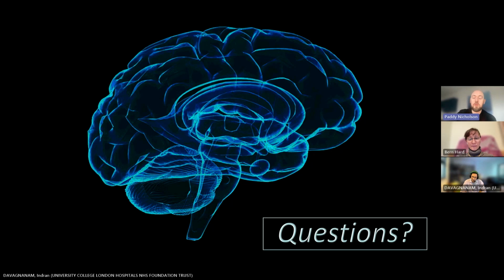So for me, that's when we use a combination of imaging. I will generally start off with a digital subtraction myelogram, because, first of all, I'm a neurointerventional radiologist, and when you have a hammer, everything looks like a nail. But joking aside, you do get a lot less artifact with a DSM with live fluoroscopic images than you will from an MRI or from CT.